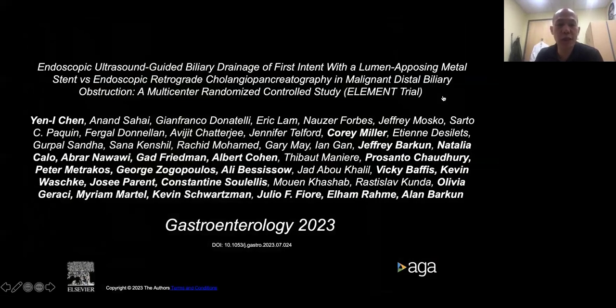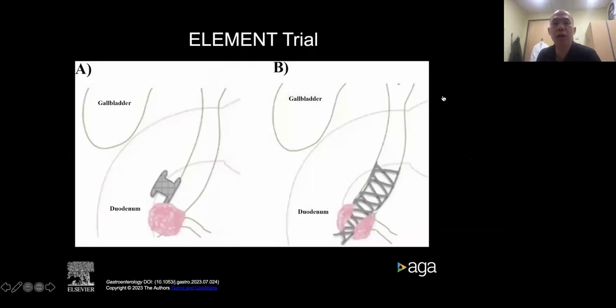As Peter mentioned, we recently finished and published a multi-center randomized controlled trial called the ELEMENT trial. This involved 10 centers from Canada. You recognize many of the names here. The whole HPB group was involved and very supportive. And thank you, Peter, again, for being supportive towards this trial. The GI group and 10 groups across Canada and 1 center in France. So this trial compared EUS-guided biliary drainage with choledochoduodenostomy versus ERCP with metal stent insertion.